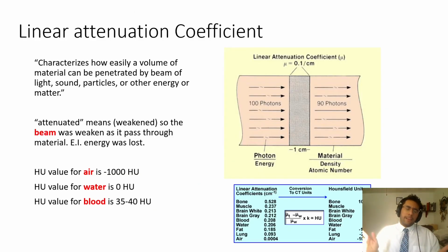It's fairly harmless. Obviously, you don't want to give patients a higher dose of radiation, so they're always developing algorithms that can determine the least amount of energy we can hit this person with while still generating an image. So in this linear attenuation coefficient here, we can see the conversion of the pixel data into Hounsfield units down here.